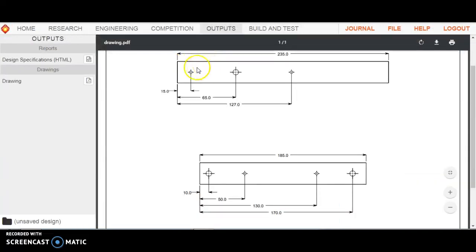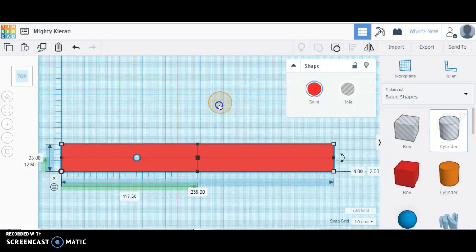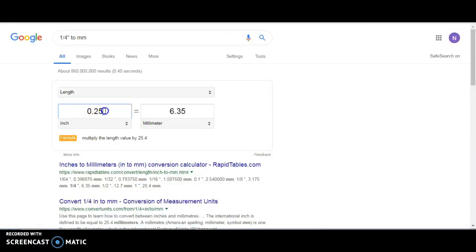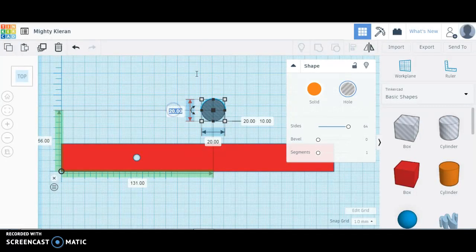Just for review, I'll go ahead and place these 1/8 inch holes as well. One at 127 millimeters and one at 15. Okay, so I need a cylindrical hole with maximum sides, 1/8 of an inch, 0.125 inches, or maybe I can type a fraction in here. Now, again, from experience, we find that we need to print this a little larger. We find that 3.5 millimeters makes for a good clearance hole for the 1/8 inch. So we know that the exact conversion is 3.175, but we're going to design this at 3.5 because we're 3D printing.